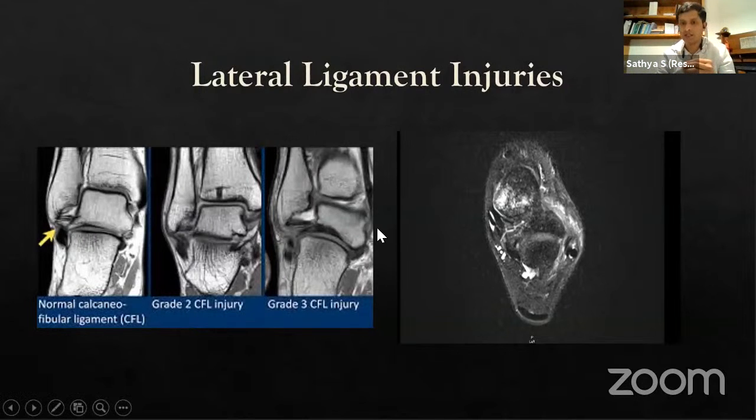That's what you're seeing. So here we are able to see the glow in the bone. This is a subchondral injury. We are able to see a trabecular fracture there. Just underneath it, we are able to see the spring ligament. That is the head of the talus, and we are able to see the spring ligament. We always study the spring ligament and other structures, and see how beautifully they look in the MRI.